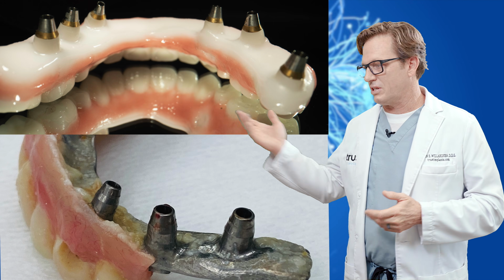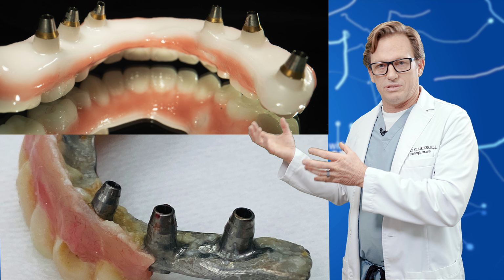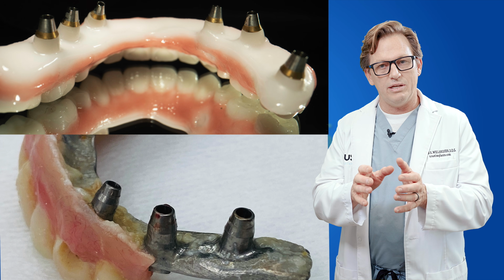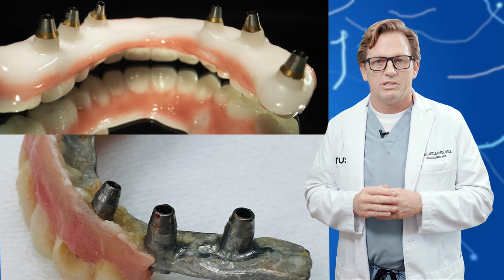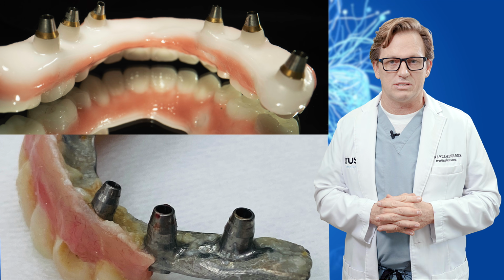You saw on the previous slide all the tarnish and debris that was collecting there. But I can guarantee you with this slide here, if I were to take this out after a year, it would look much different than a titanium framework. So these are all factors that have to be considered when doing these sort of cases.